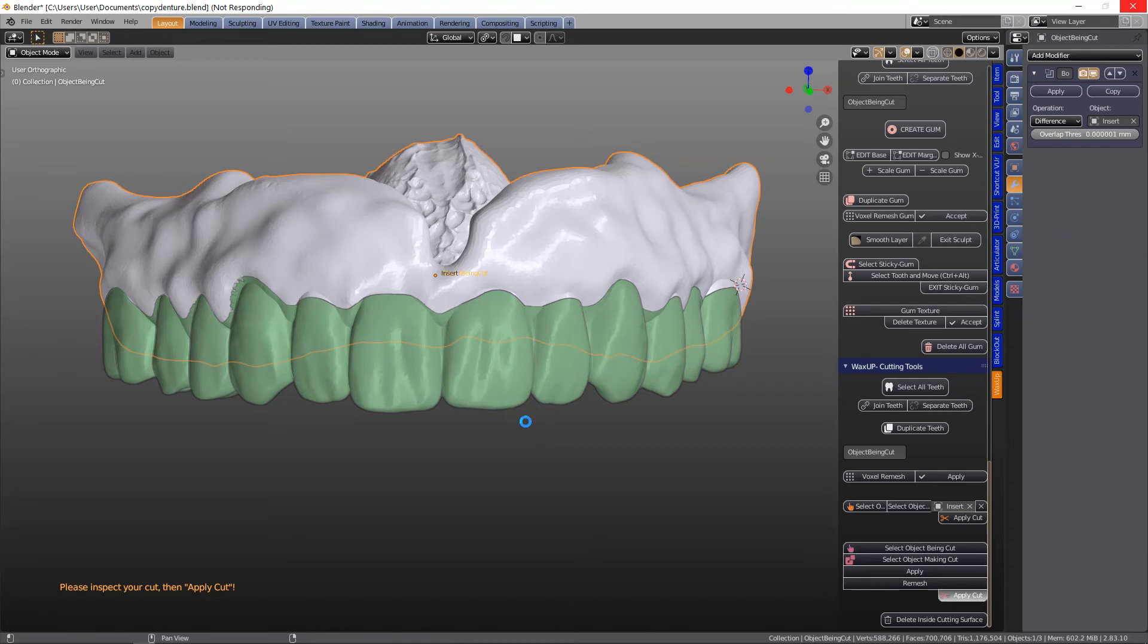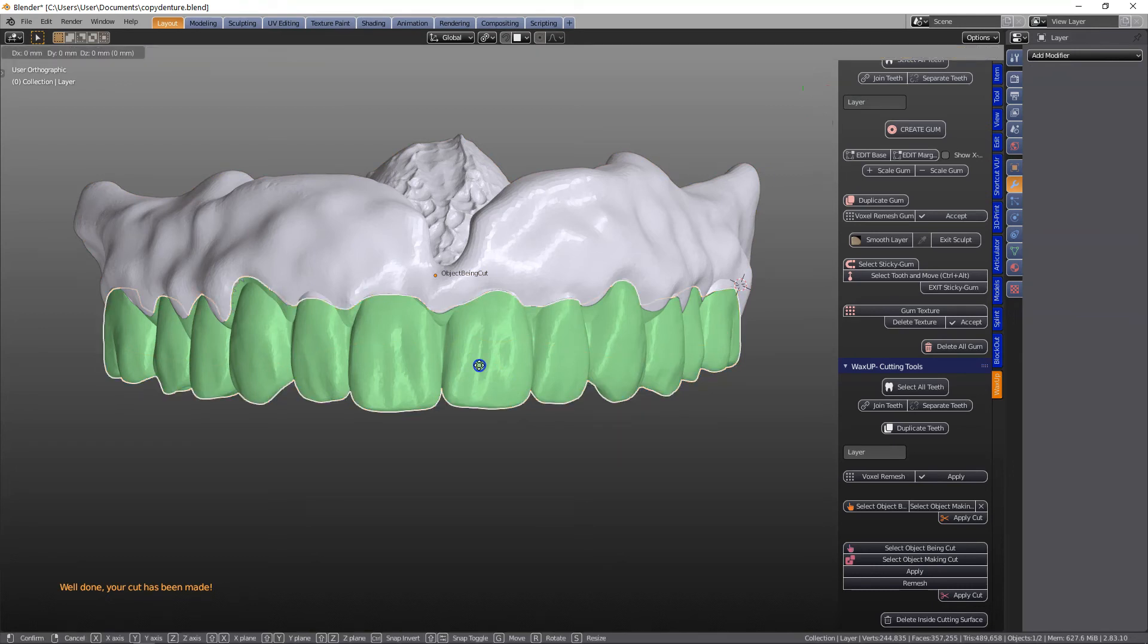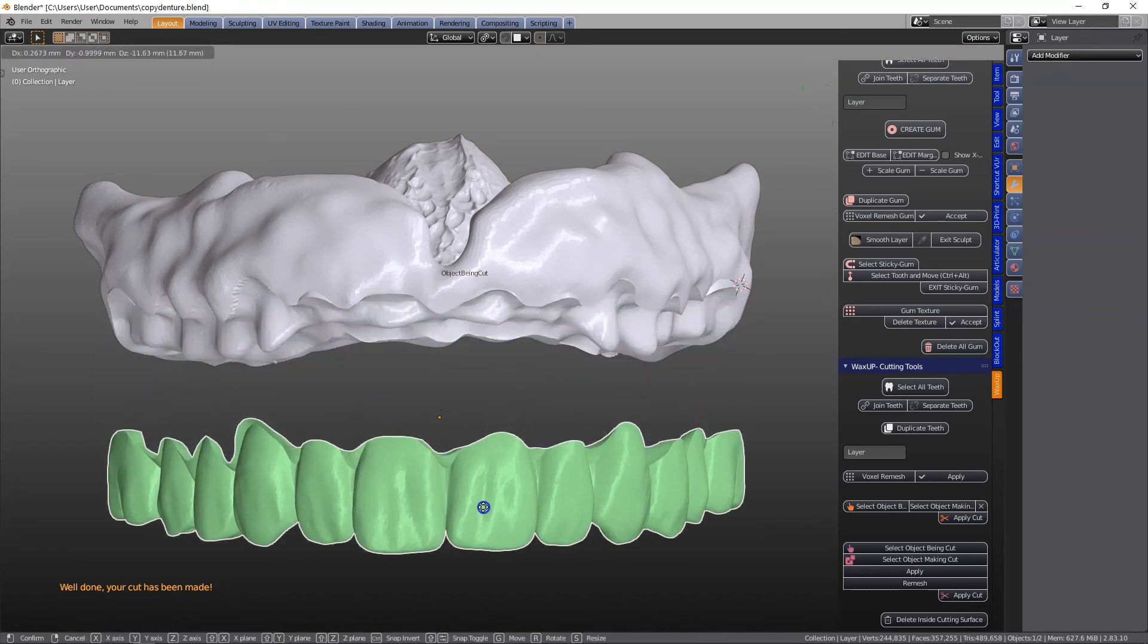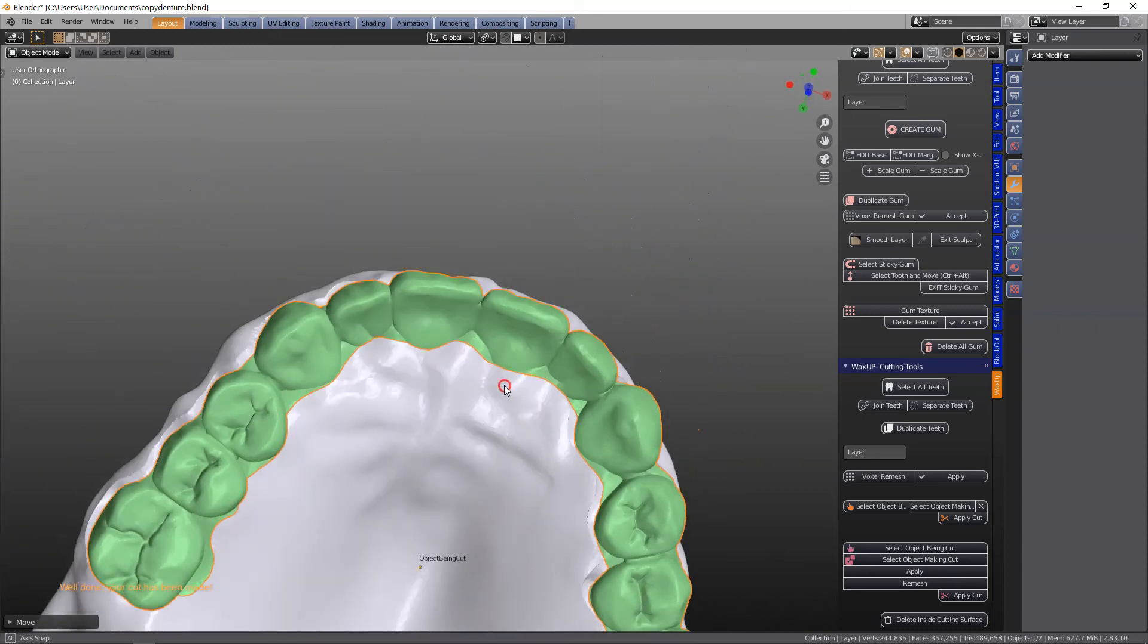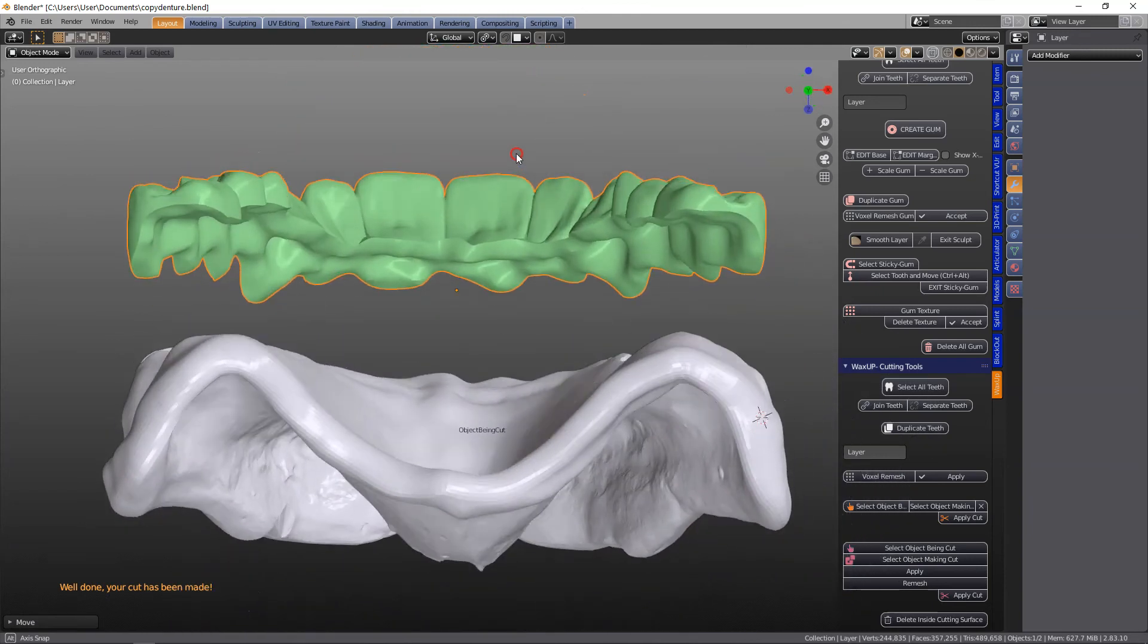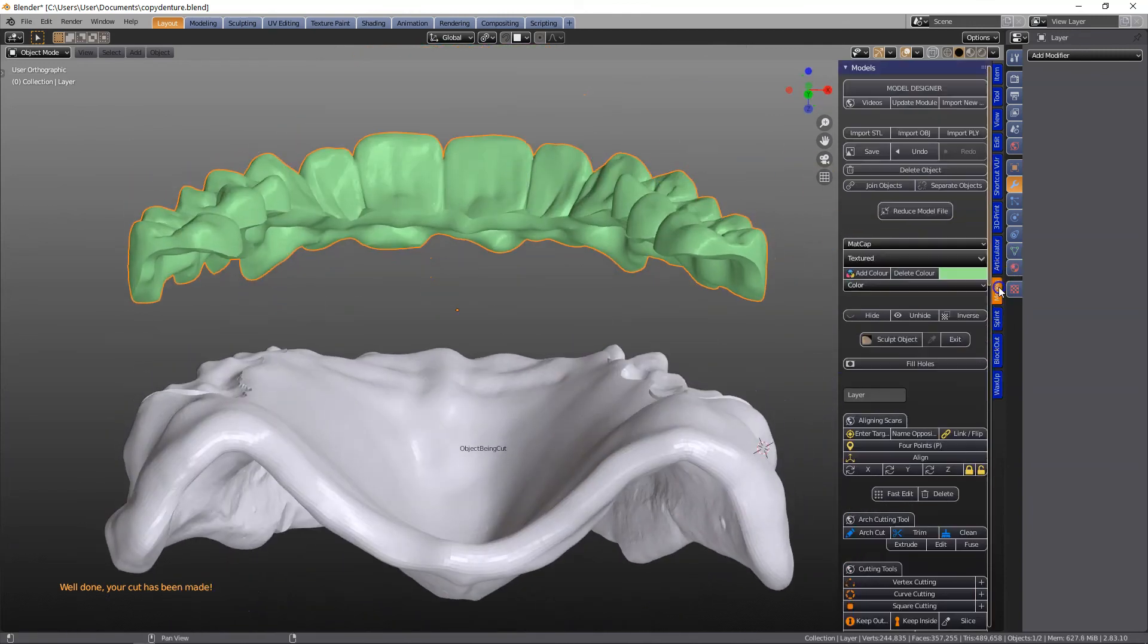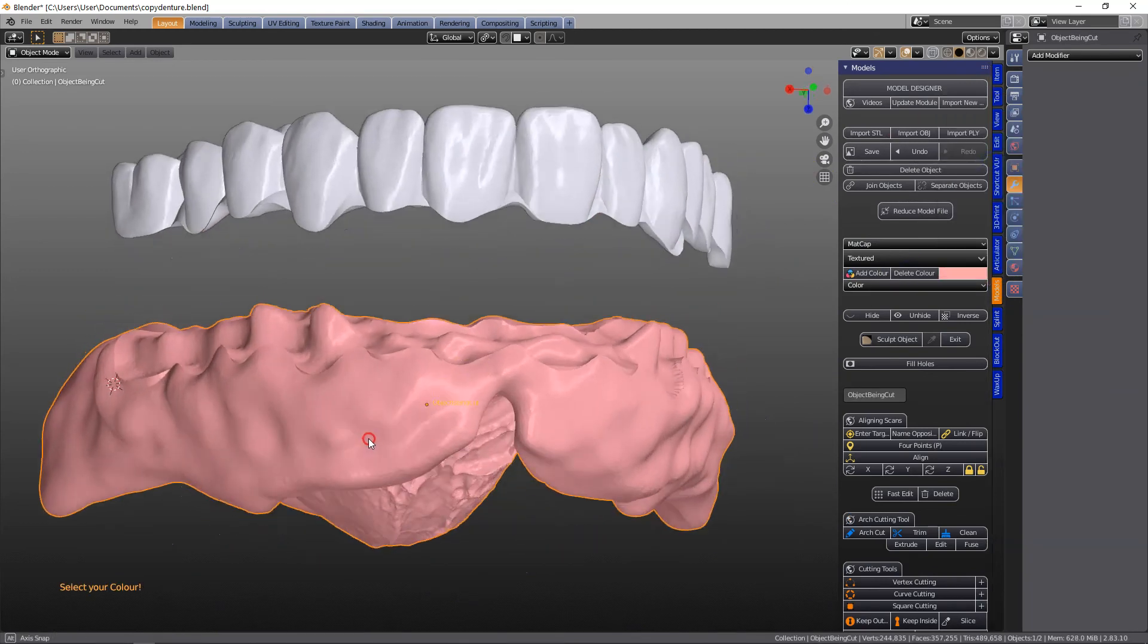Let's see how that looks. So I'm going to grab this downwards and here we've got our two separated, and additionally to that we have a little bit of mechanical retention so one of them should fit snugly into the other one.